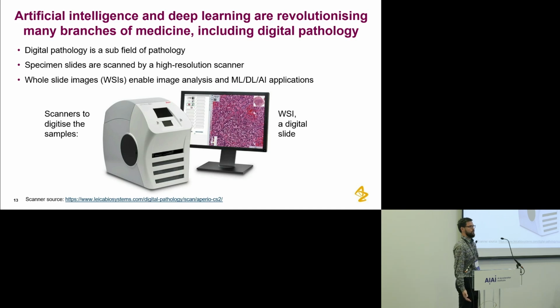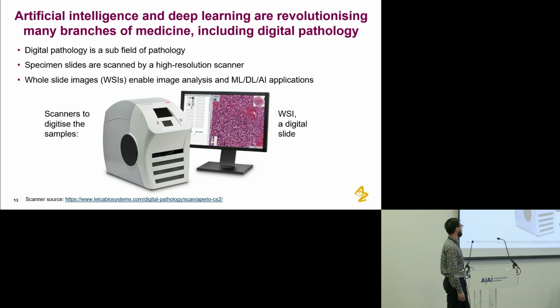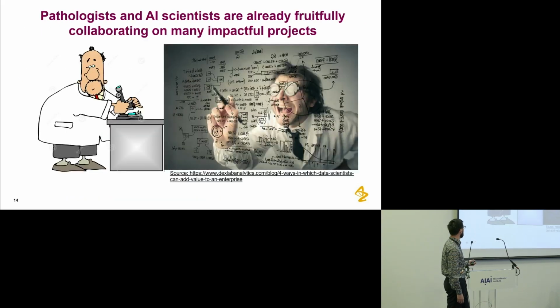And once you have these images, you can apply artificial intelligence, you can apply computer vision algorithms, and train different algorithms to detect some specific cancer cells or even cancer regions. A lot of research is happening there, and it's actually what I'm working on these days at AstraZeneca.